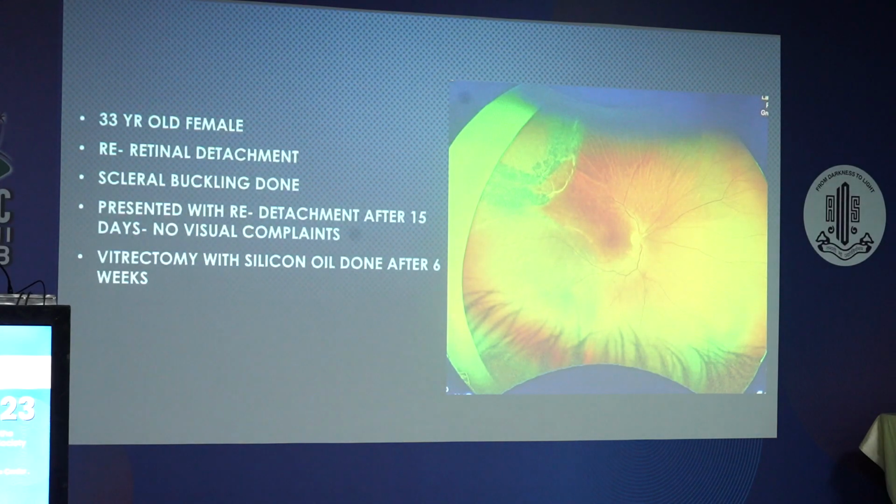So what would it be now if I flattened it from the inside, if it is a retinal cyst, would it show up now? No, what happened to the cyst when you did the internal drainage? What happened to this cystic lesion? It settled. Okay. So if it was a retinal cyst, would it show up now in the collapsed retina, or would it not? It just flattened out, and after some time you won't know that there's a cyst. Okay. It's chronic degenerative changes, but it just flattened out.